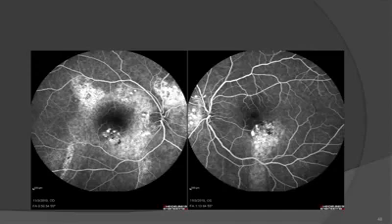Thank you. Okay, so first of all, how to differentiate between cases of posterior uveitis versus non-uveitis, as shown in my case. It's very important to get multimodal imaging to reach your final diagnosis.